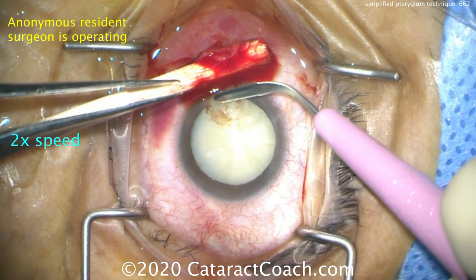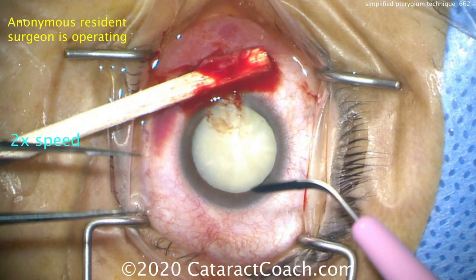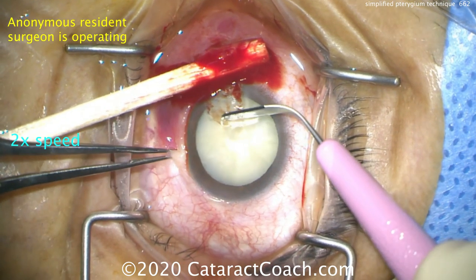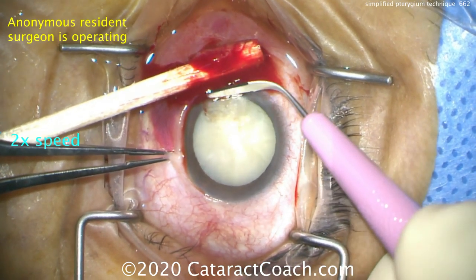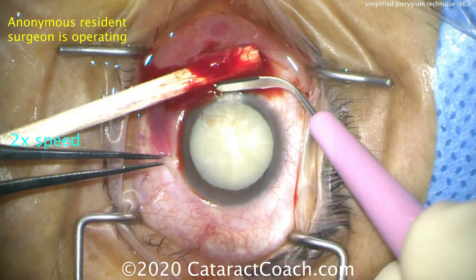We can use the back end of the crescent blade using this quick motion, keeping the blade perpendicular to the corneal surface — that's a nice way of smoothing it out. You can also use a diamond tipper. Just remember, your goal is to be as gentle as possible.